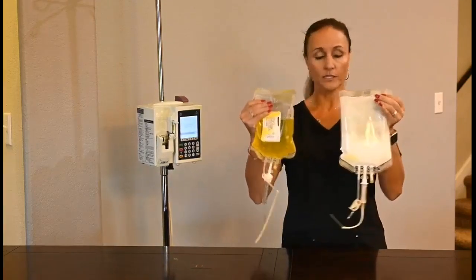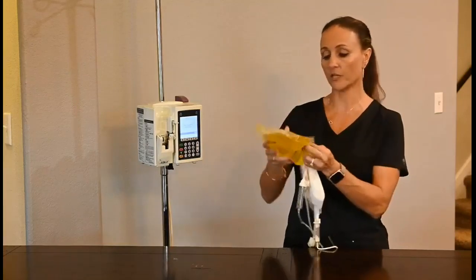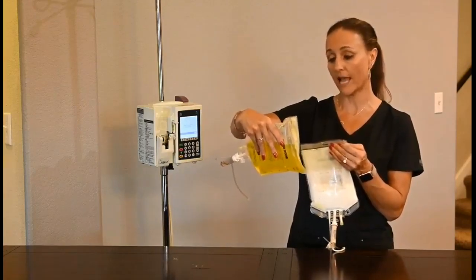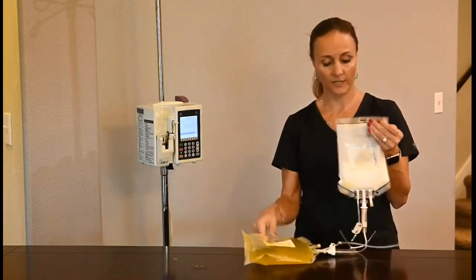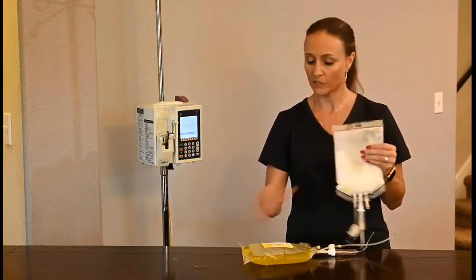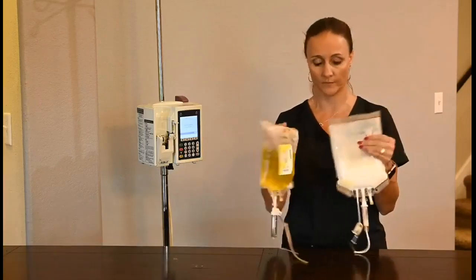With these two, the difference is that this has lots of different kinds of medication that's been added to it, such as amino acids, dextrose, calcium, potassium, sodium, and you can even add insulin. Now, what is this bag? If it's separated, that means that what makes it white is the lipids. So these are the different types of TPN or PPN that you may see.